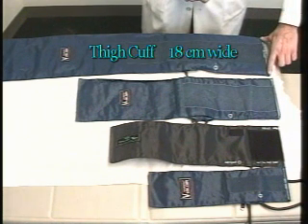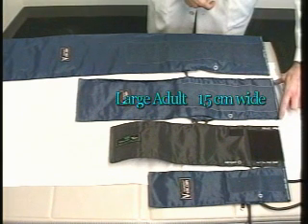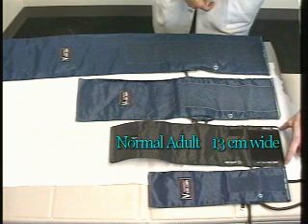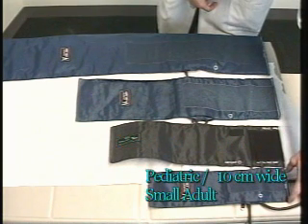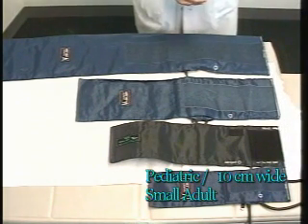The width of this cuff is approximately 18 centimeters. The next largest cuff is known as a large adult blood pressure cuff, and this one is approximately 15 centimeters wide. Then we have the normal adult blood pressure cuff, and it is about 12 or 13 centimeters wide. And finally, we have the smallest blood pressure cuff, which can be known as a pediatric or small adult cuff, and this one is about 10 centimeters wide.